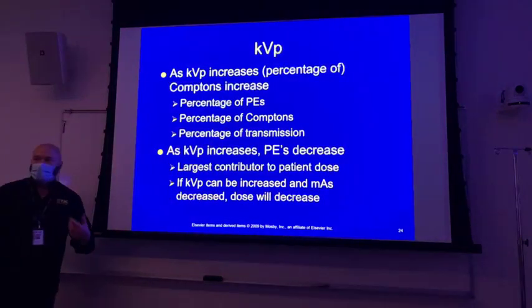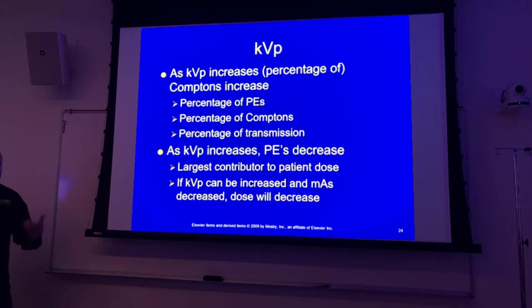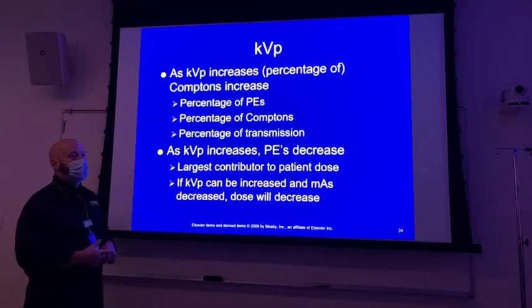So if you find yourself working in a hospital where you use 100, 110 kVp on portable chest X-rays, what are your options? You don't have leaded walls in a patient's room. Stand behind the portable, right.